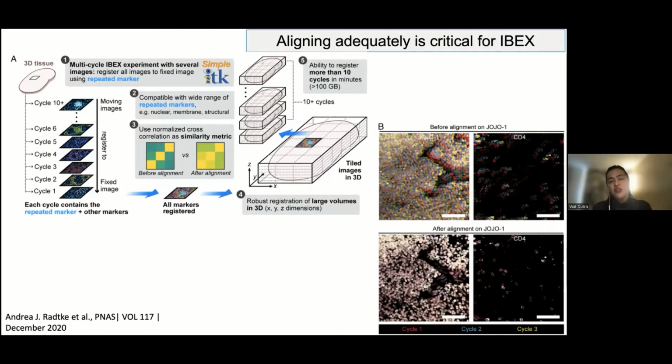So if you have 7 channels, you read each slice for each of the channels that you're acquiring. So it's quite a time-consuming thing. So you want to be sure that when you acquire the subsequent cycles, you acquire in the best possible place to help you align it later on with the software. So the software really is very good.